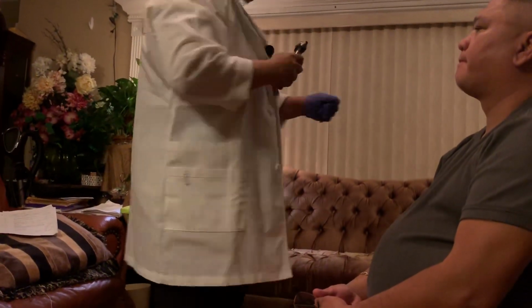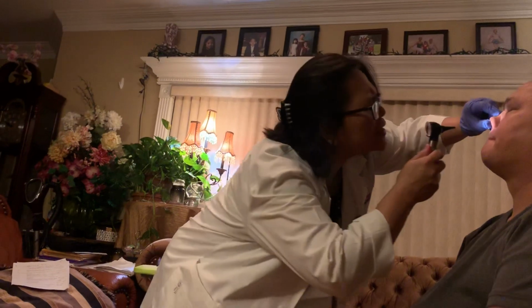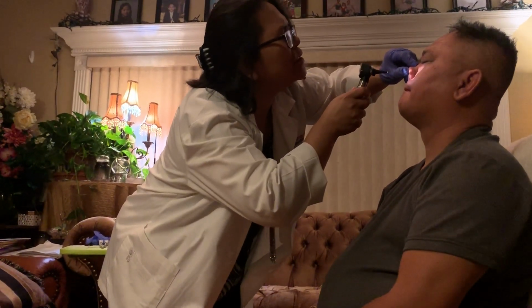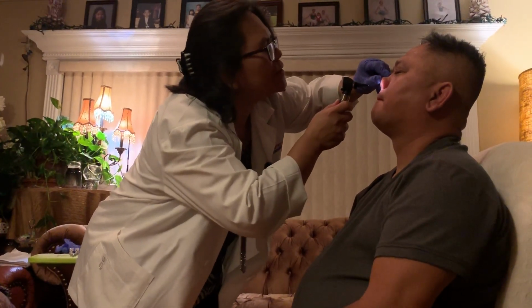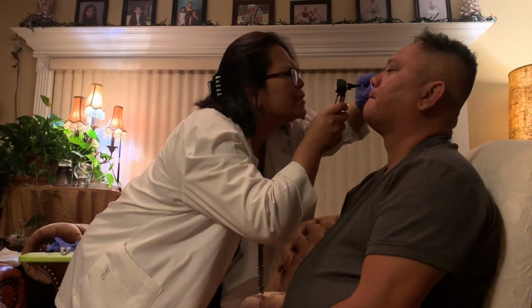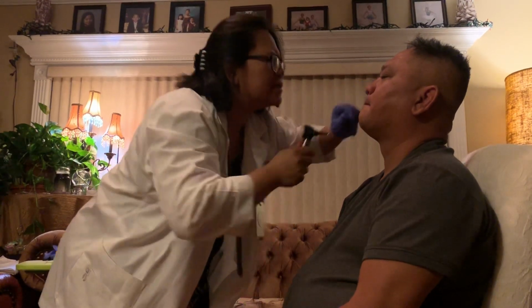Okay, so I'm gonna use this. All right, so let me check. Okay, I could see your nasal membrane. It's moist, it's pink, there's no nasal discharges, and there's some hairs. Okay, let me see your right. The same thing. Okay, it's moist, it's pinkish, there's no nasal discharges, and then there's hairs.